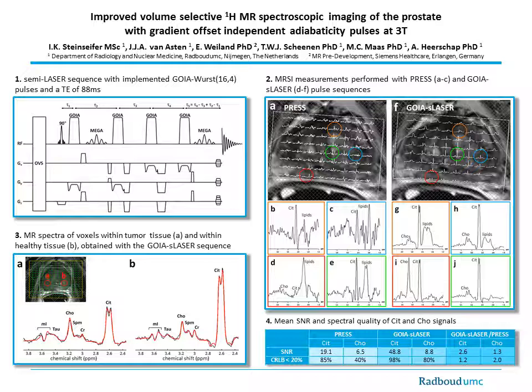However, prostate spectra often suffer from contamination originating from lipids surrounding the organ. These lipid signals can overlap with those of citrate and cause uncontrollable phase effects. This is a problem for quantification and tumor characterization, especially at the margin of the prostate where most tumor foci are located. Therefore, our aim was to develop a 3D MRSI sequence which produces reliable spectra across the whole prostate without spectral contamination and within a short acquisition time.